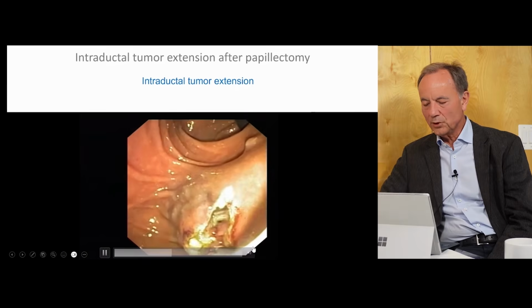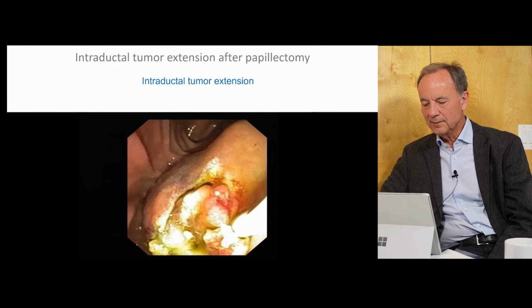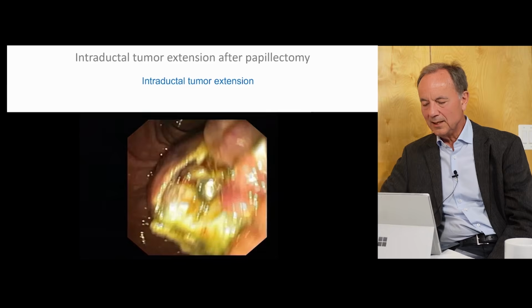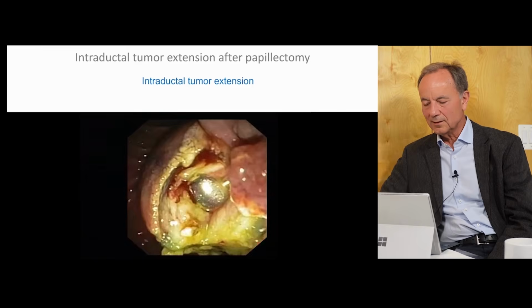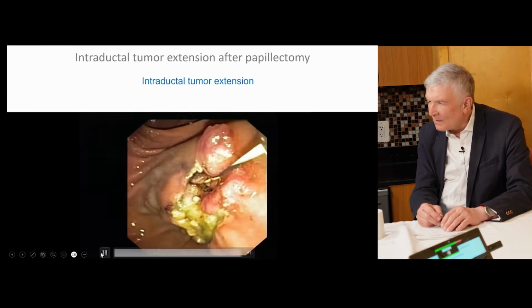Yes. And what you can do is to use a balloon catheter to inflate it in the mid portion of the CBD and to pull this neoplastic tissue out of the duct. This is an option, and then to snare it. Quite a bit, huh? Yes.